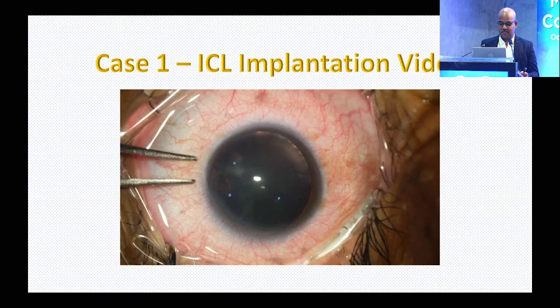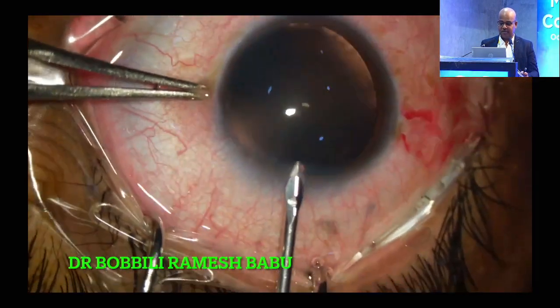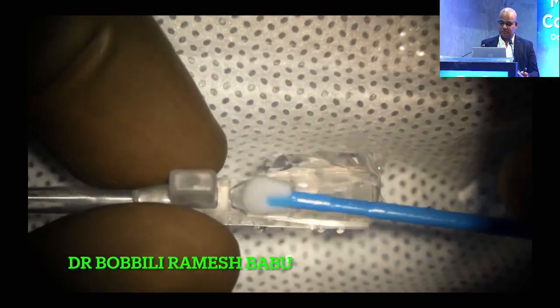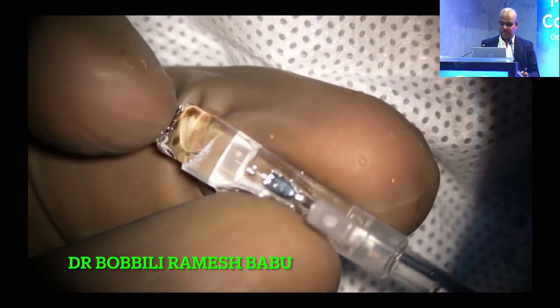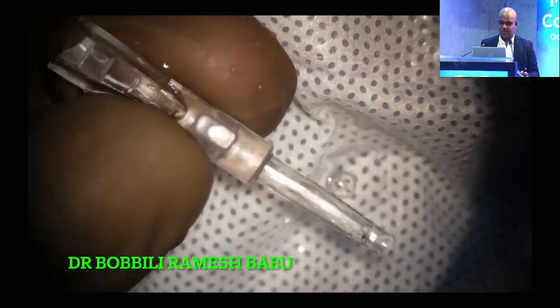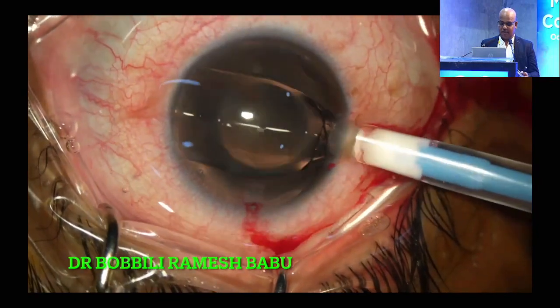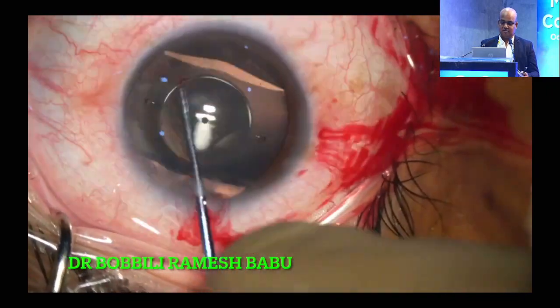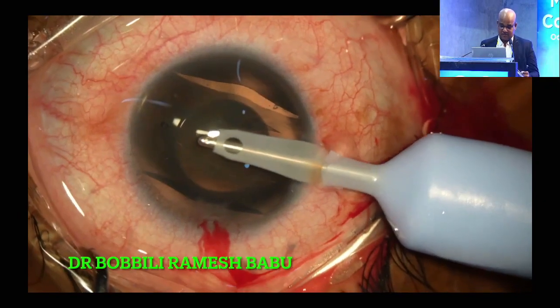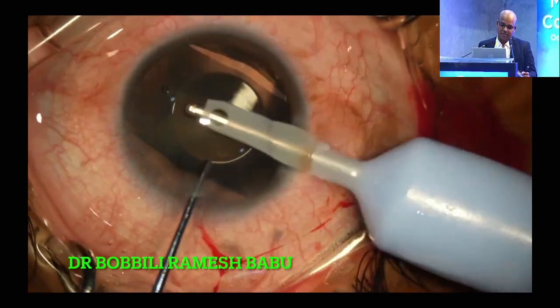This was the technique of ICL. First a main port of 3.2 mm is made. Then a side port; I have a habit of making only one port, and the ICL is loaded. Then with Kelman-McPherson forceps, it's being loaded onto the cartridge. We pull the cartridge over the ICL, and the lens is now being implanted. First before the iris, then we'll be tucking the footplates behind the iris.